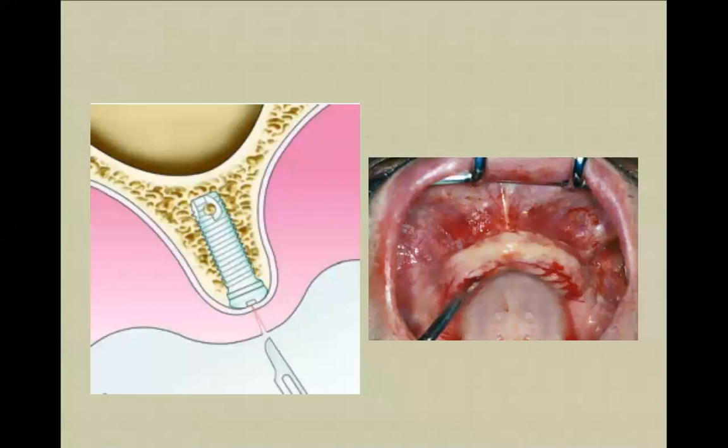You can think about a temporary prosthodontic device, if this is an edentulous maxilla or edentulous mandible, if the patient insists on that. If not, it is better to avoid it, because this prosthesis might interfere with the osseointegration process, so that's also not good. And you're waiting 3 months for the mandible and 6 months for the maxilla.